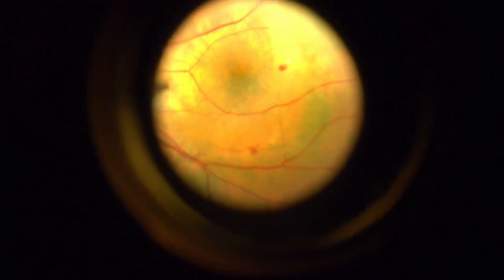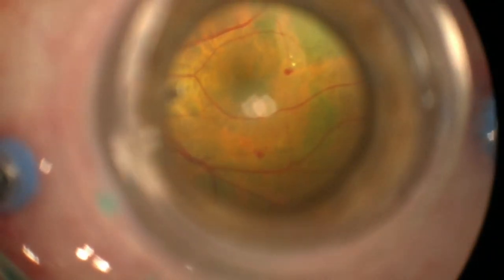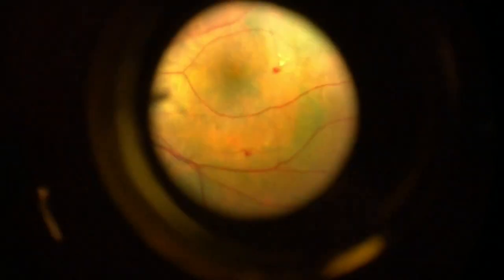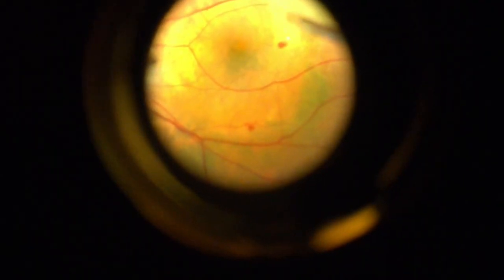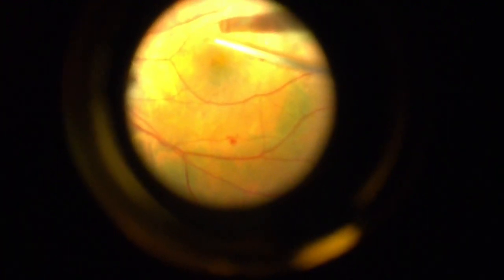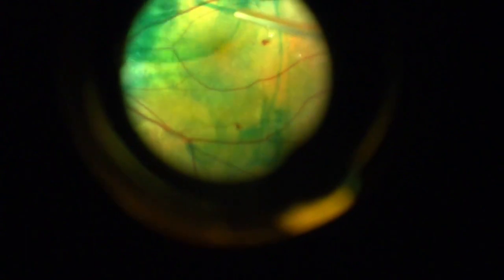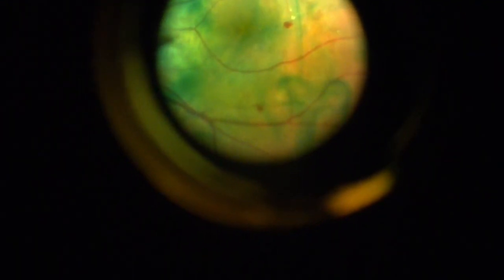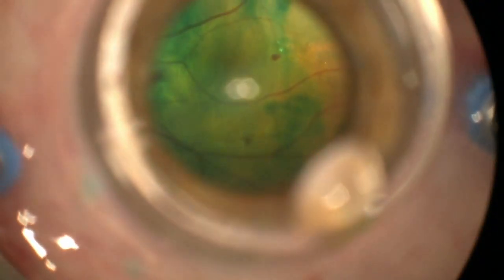I try not to stain more than two times. Ideally, you get one stain and you're done, just because it avoids toxicity issues, putting more stuff in the eye. So we'll just do a little puff here and here and here and here and gentle. That's gentle. That's very gentle. Got it. Very gentle.